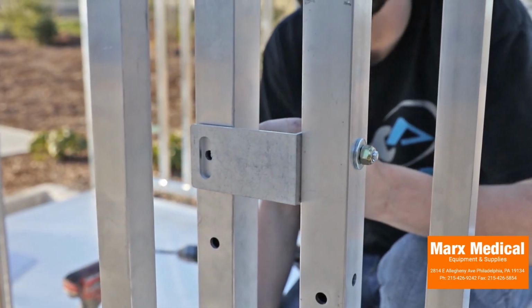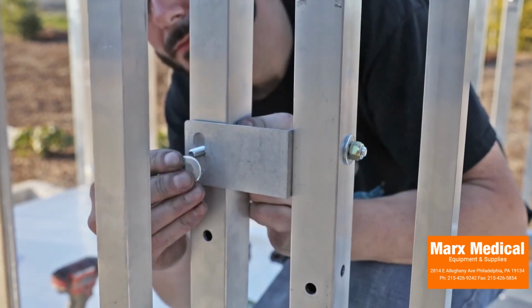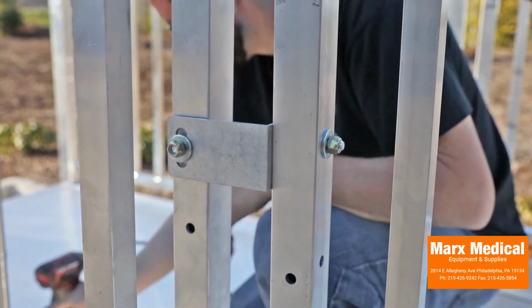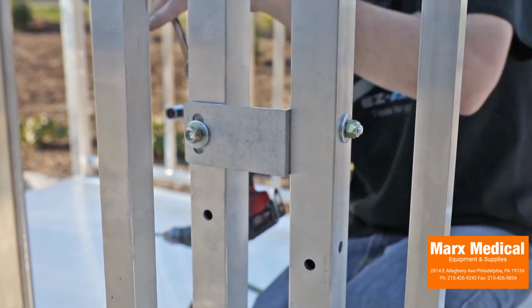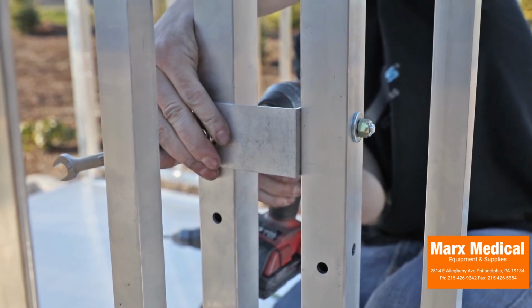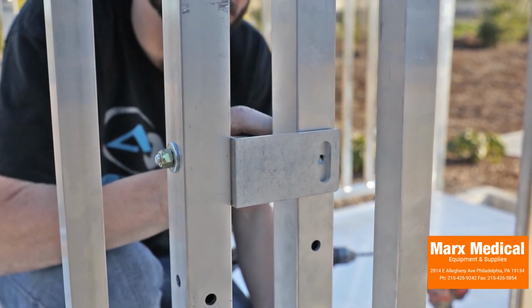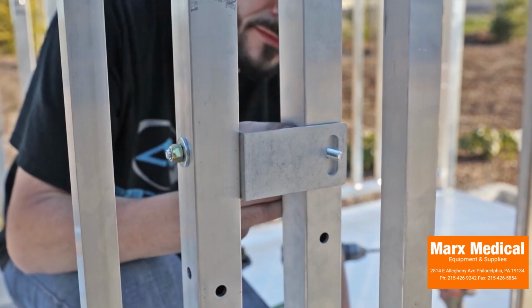At all locations where a ramp frame post is not connected to a closure, it must be connected to a platform angle post using a ramp closure bracket. Orient the bracket with the long leg contacting the platform angle post and the short leg contacting the ramp frame post. Install a 5/16 by 18 by 2 1/4 inch long hex bolt through a flat washer, the short leg of the bracket and the ramp frame post, then secure with another flat washer and a nylon insert lock nut.